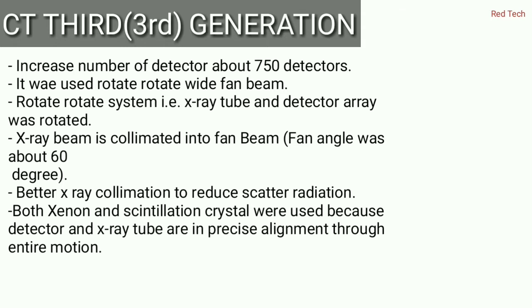We call it wide fan because the fan angle was about 60 degrees, as compared to the second generation, where the fan angle was about 10 degrees.